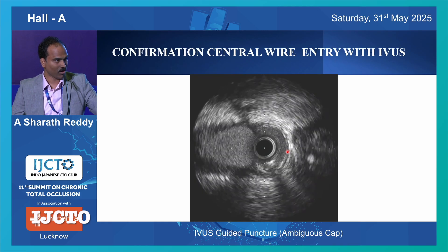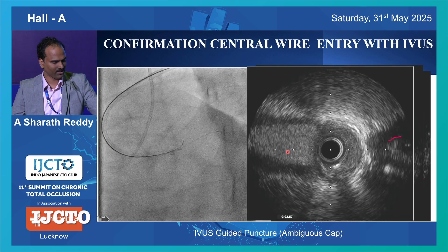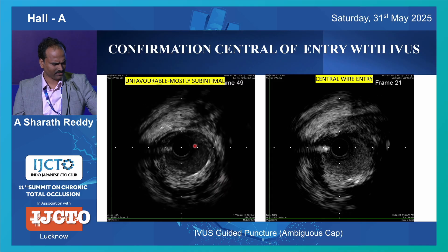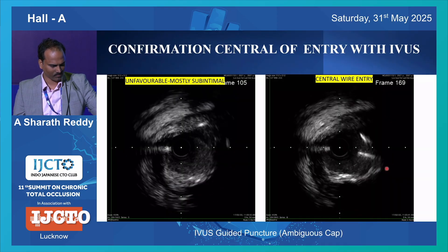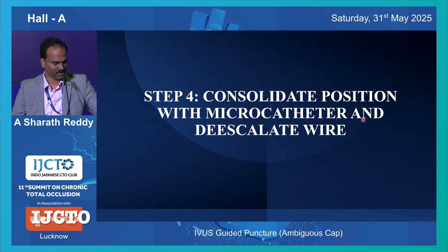Now you have to confirm where your wire is - it should be completely centrally located. In all views, the wire should be within the media. This is the media - it is within the media in all views. At the confluence as well, it should be within the two goalposts of media. This is how the wire should be on IVUS. Once that is confirmed, you can go ahead with the next step. On HD IVUS, you can see this wire is basically sub-intimal. The block is here and we rewired with Harnet - now this is the appropriate location. The first wire was sub-intimal - had I continued with that wire, it would have been a catastrophe.